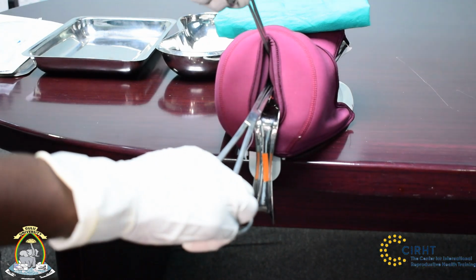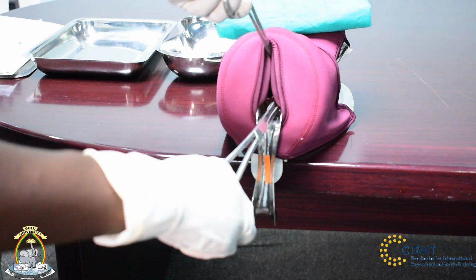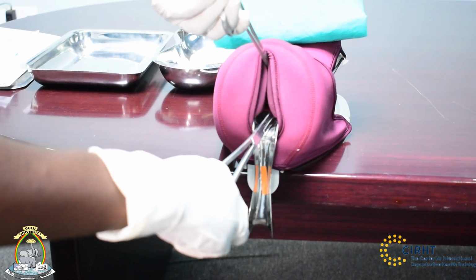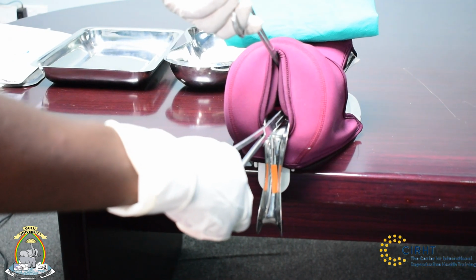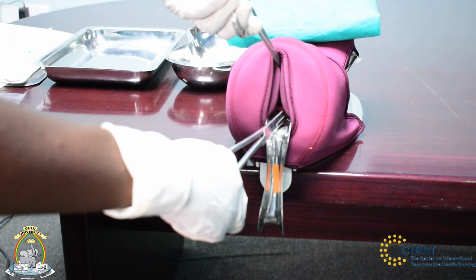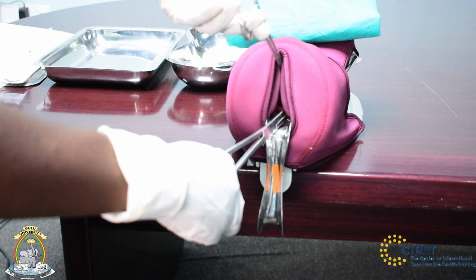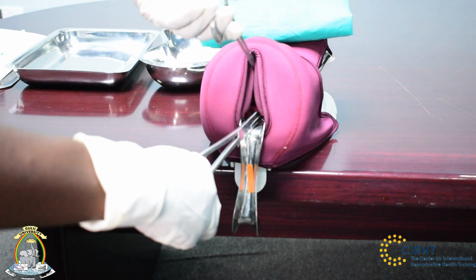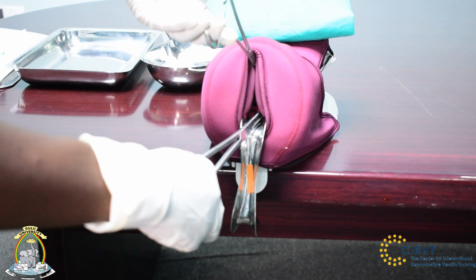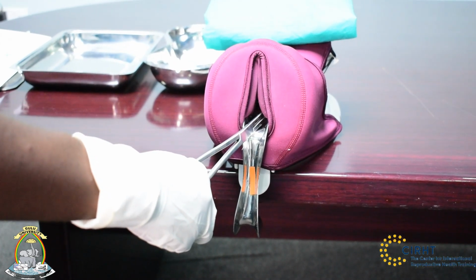So we shall advance it slowly until we feel a bit of resistance. So where we feel the resistance, we are going to pause just a bit. So at this point, we do not need our sponge holding or ring forceps, so we shall remove them. So we remove and we set it aside.